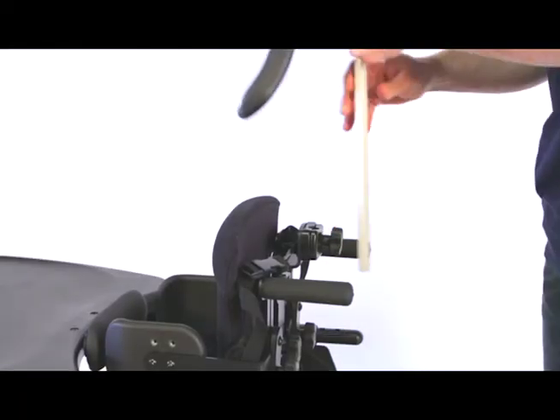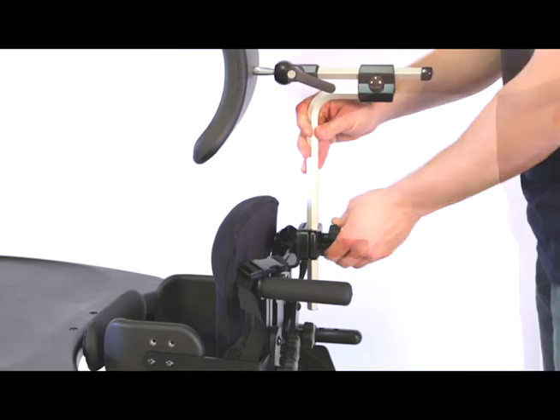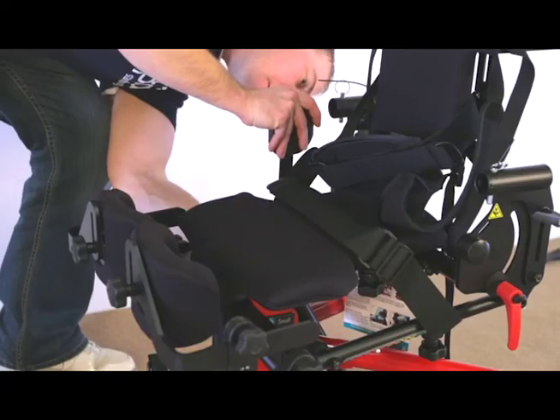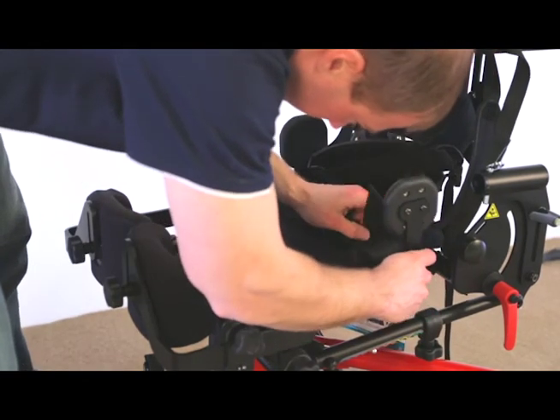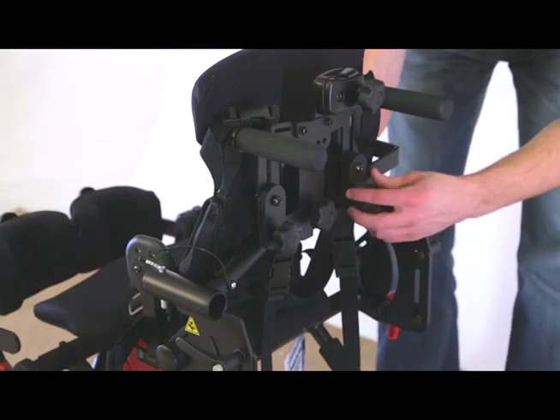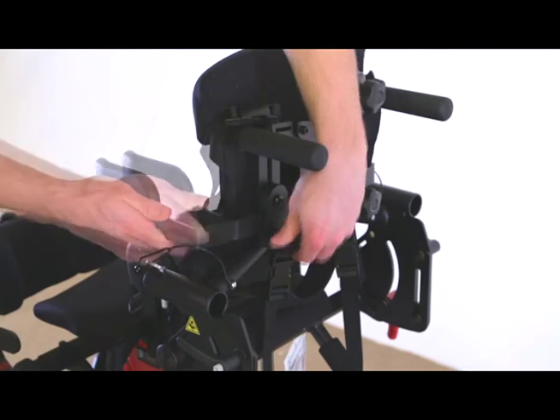If you ordered only the optional headrest, insert the head support onto the unit and tighten securely. If the optional hip guides were ordered, insert the hip guides into the clamps underneath the seat and tighten securely. If the optional lateral supports were ordered, insert the lateral supports into the clamps on the back and tighten securely.